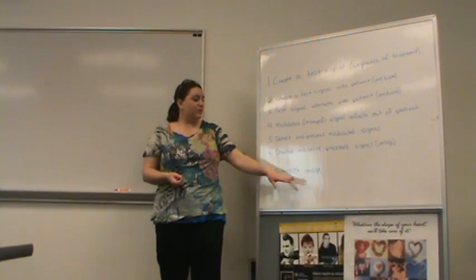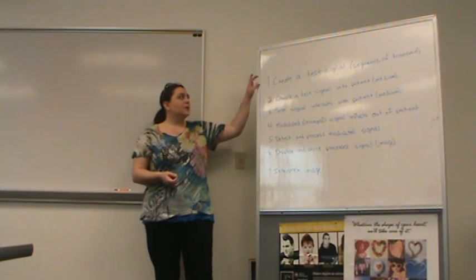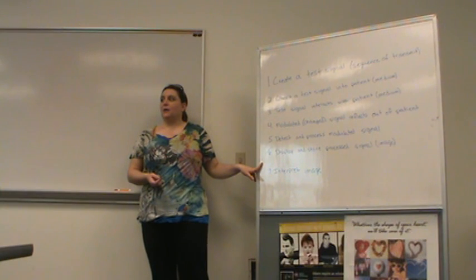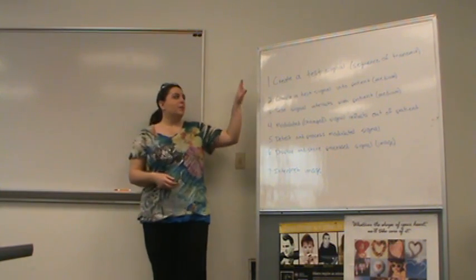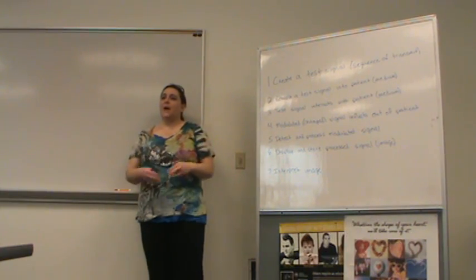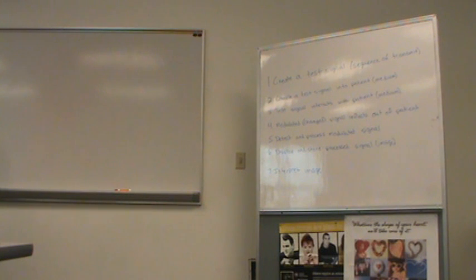All of this is so that we have an image that we can interpret and recognize what's going on with it. So we're going to talk about all these different steps and kind of you sitting down at the machine saying, okay, what's going on through all of this process and how is it interacting with us. So we're going to start with that first one that says create a test signal.